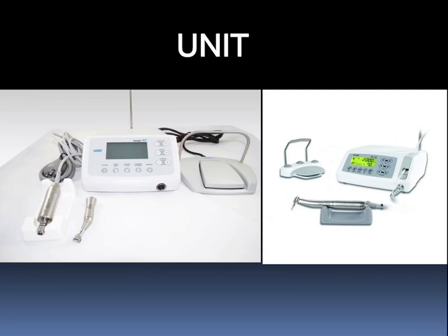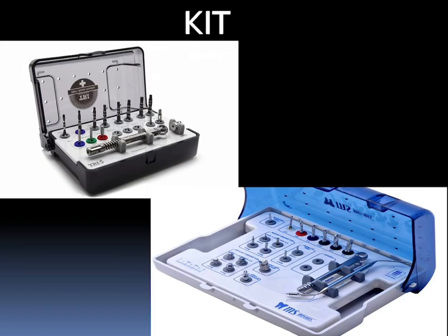The implant, when it is placed, can be motor driven or hand driven, but for drilling what we use is the normal physiodispenser unit.